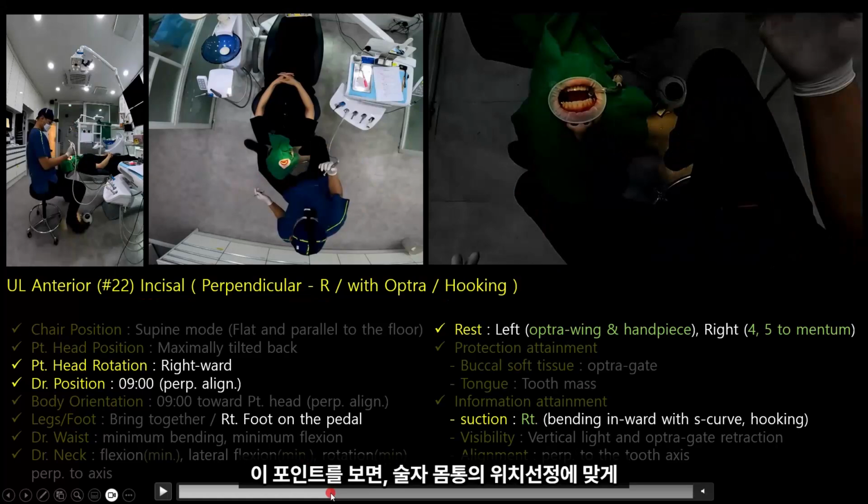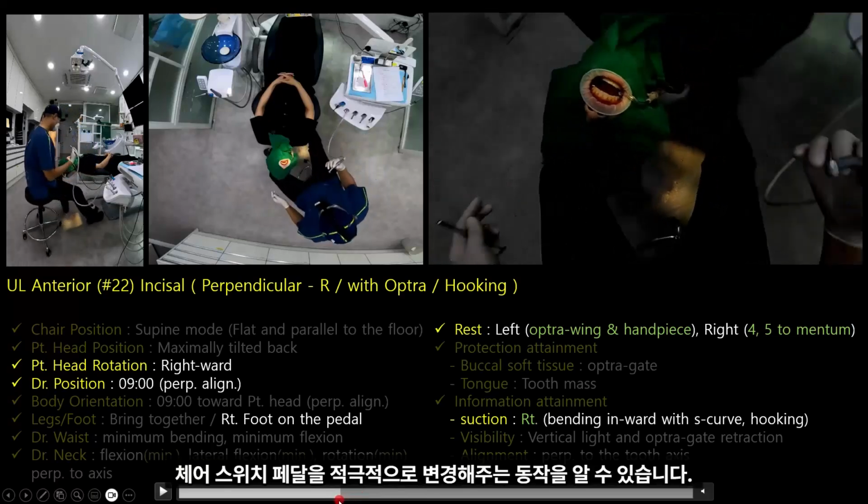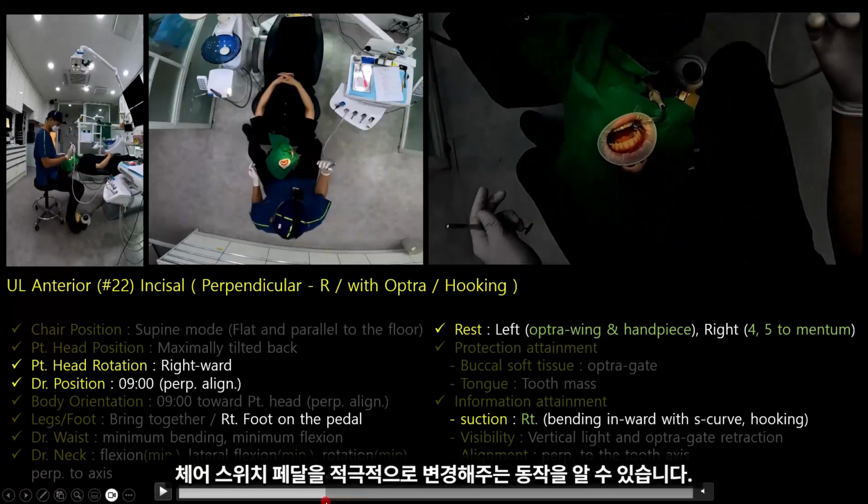Now, if you examine this section, you'll observe the action of actively adjusting the chair switch pedal to align with the operator's body positioning. Let's consider it from this perspective.